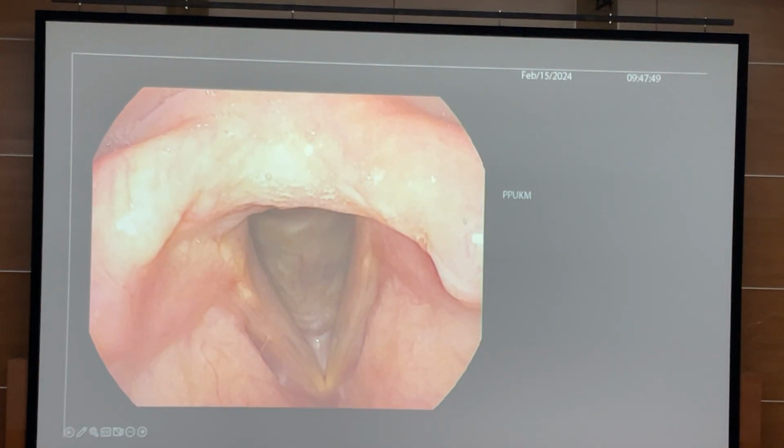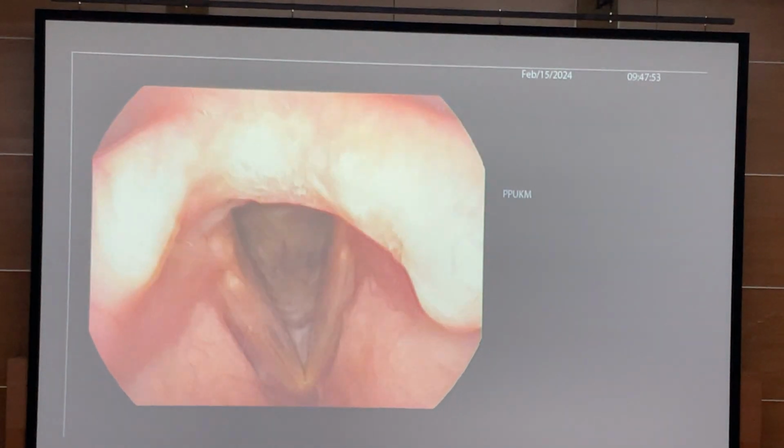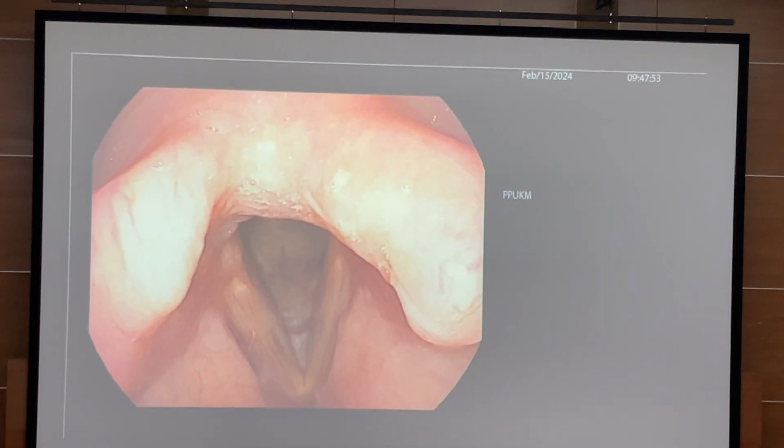Right. Tell me what you can see from this larynx. Again, in this course, each speaker will keep on telling you, do personal examination. Please do personal examination. What does it mean? You have to bring the camera as near as possible to the vocal fold for you to see any structural issues.